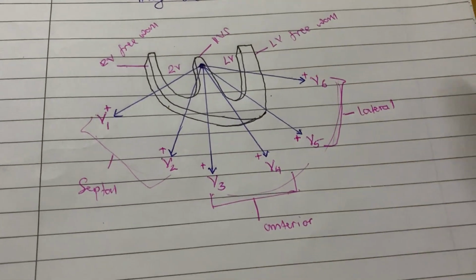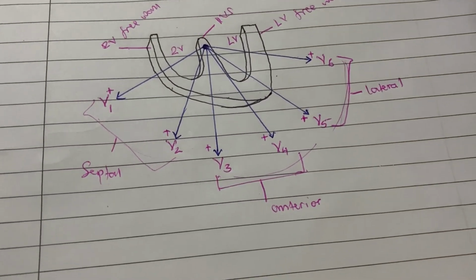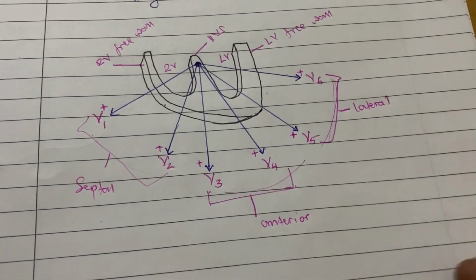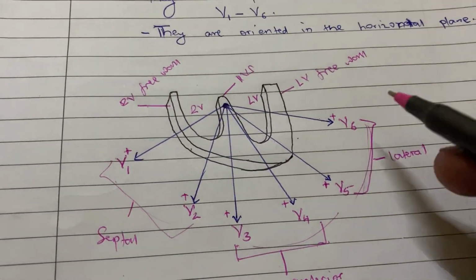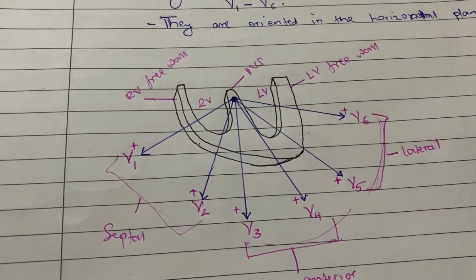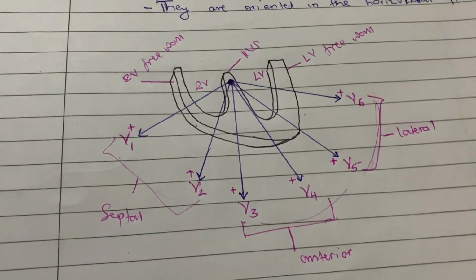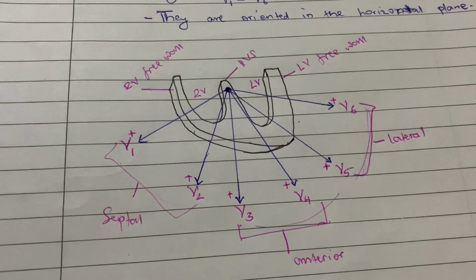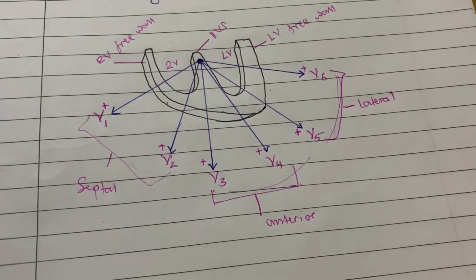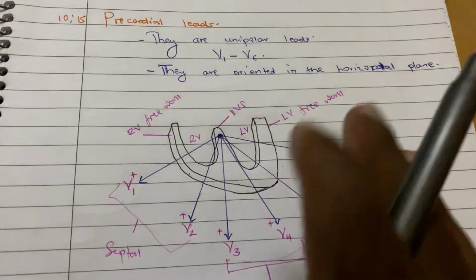From the limb leads, we also had lateral leads, AVL and lead 1, but those were high lateral. So V5, V6, 1 and AVL, these are lateral leads. Anterior leads are V3, V4. Septal leads, V1, V2. Inferior leads are 2, 3 and AVF. That one is labeled. This is the orientation done.